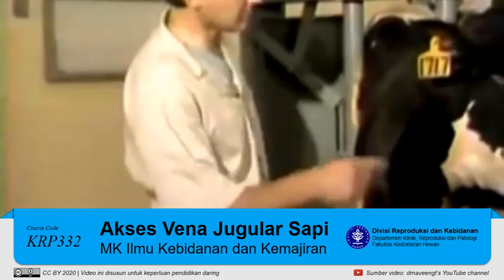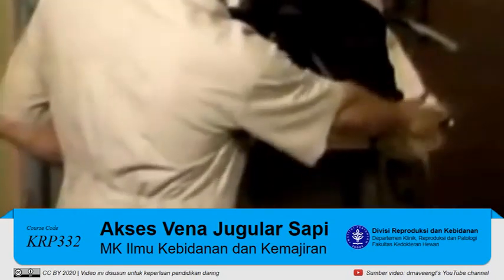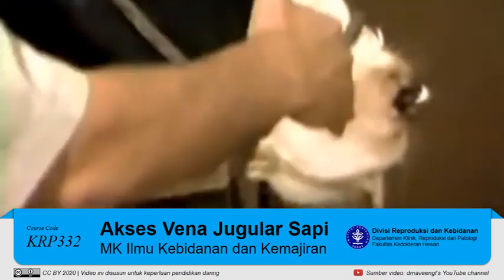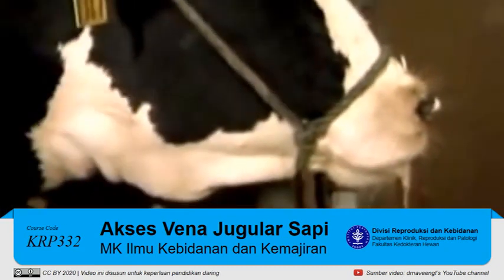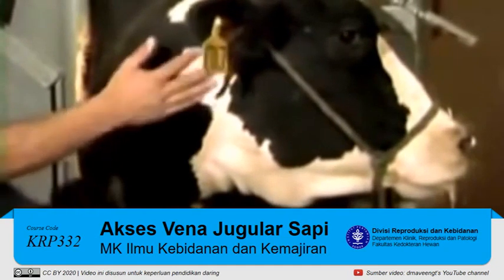The first essential thing is to make sure the head is restrained properly. She has her halter tied very tightly and she also has a nose lead which has slightly less tension on it. Hold around to the side and you want to get as much leverage there as possible, because a cow like this one that's had a lot of medication begins to react as soon as you touch her.